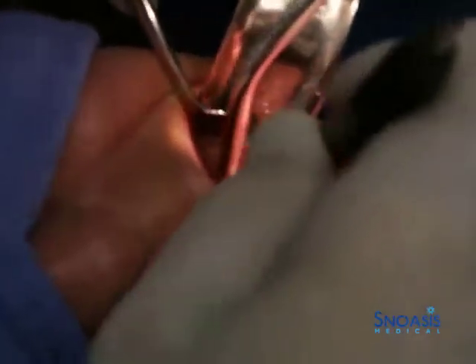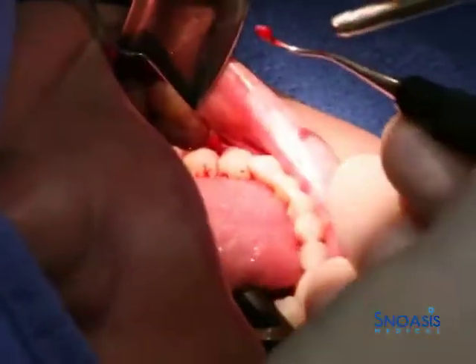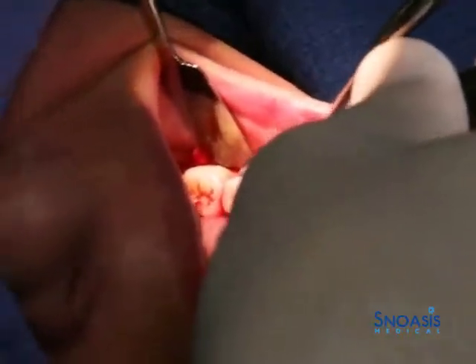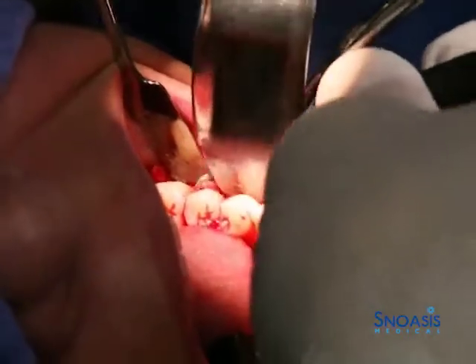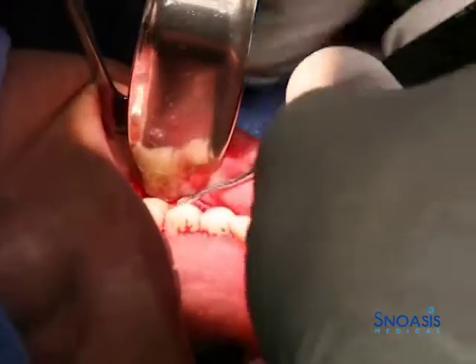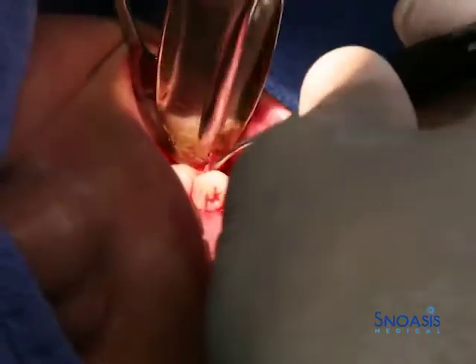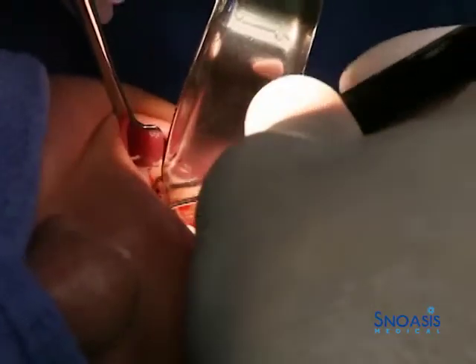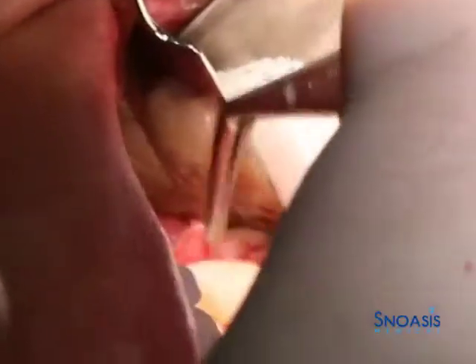Okay, so we just got a couple of intrabony defects and got some granulation tissue out of the defect there. It comes out in a big, nice piece like that if you take the 15 and degranulate, or just remove some of the granulation tissue with the 15 first. So what we're going to do is pack a little gauze in there, and then we'll be able to see the defects a little bit better.